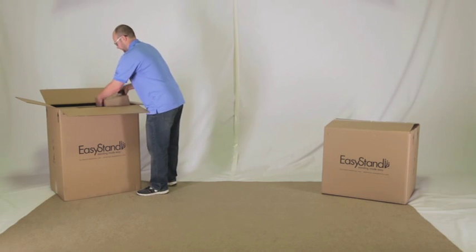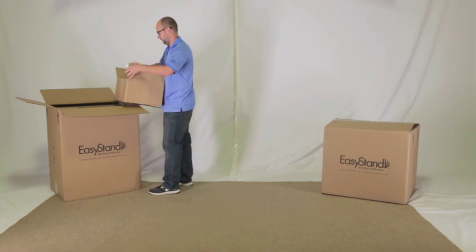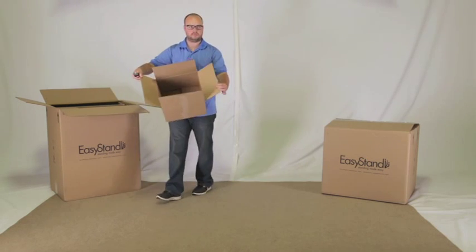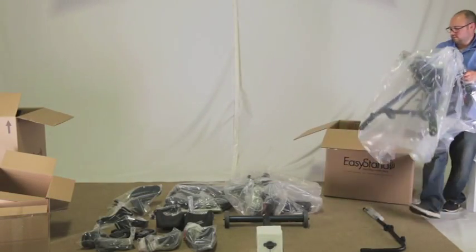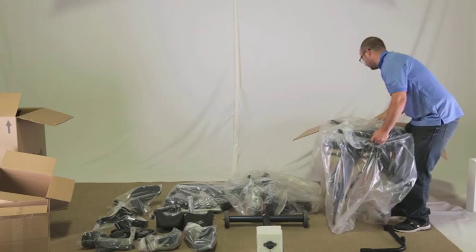First, we will start by removing all the parts from the two boxes you received. Some of the boxes are left empty for packaging purposes. Remove all plastic wrap from the parts.